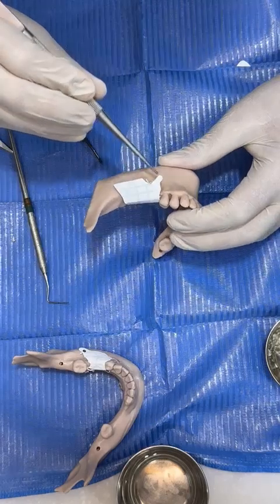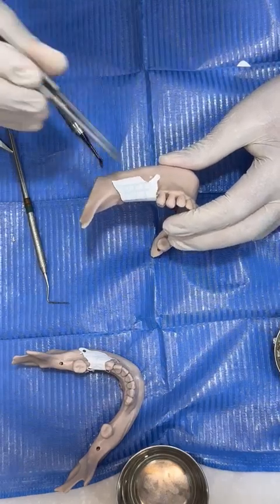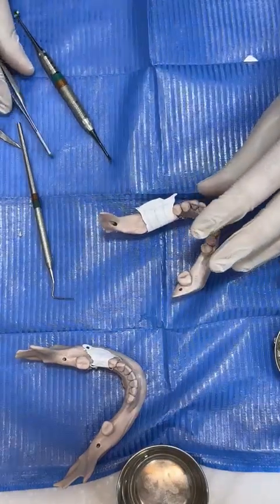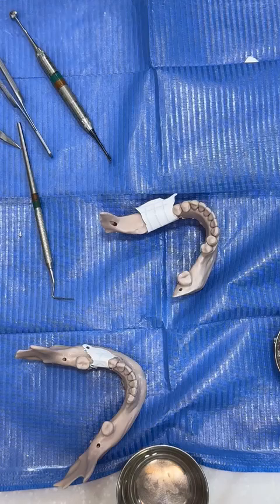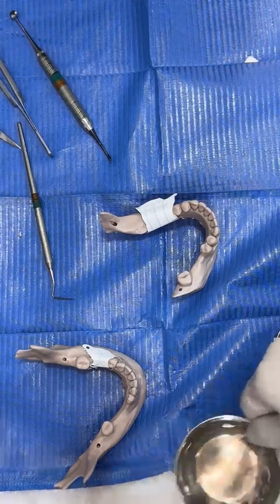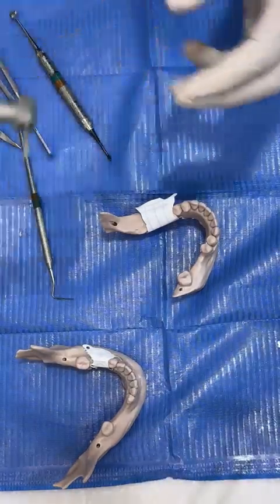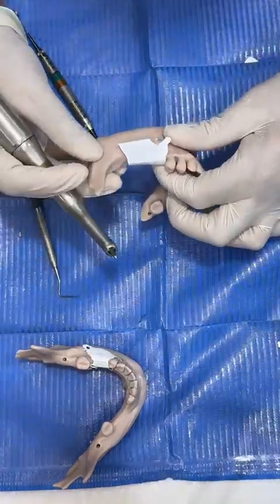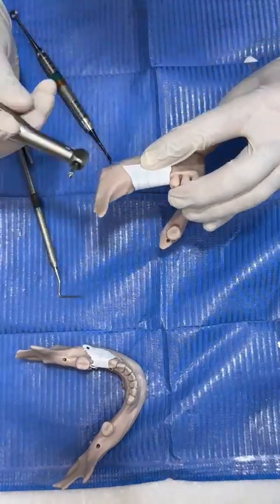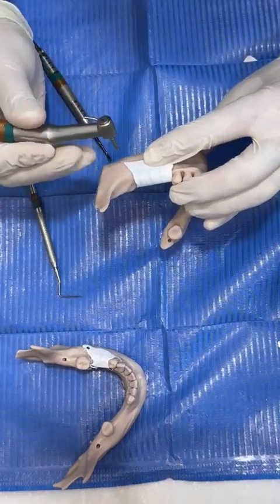Okay, now we can start fixing the disto-buccal screw here. Okay, I will get one more Profix. Clear. Okay. And then I will fix the disto-buccal one.